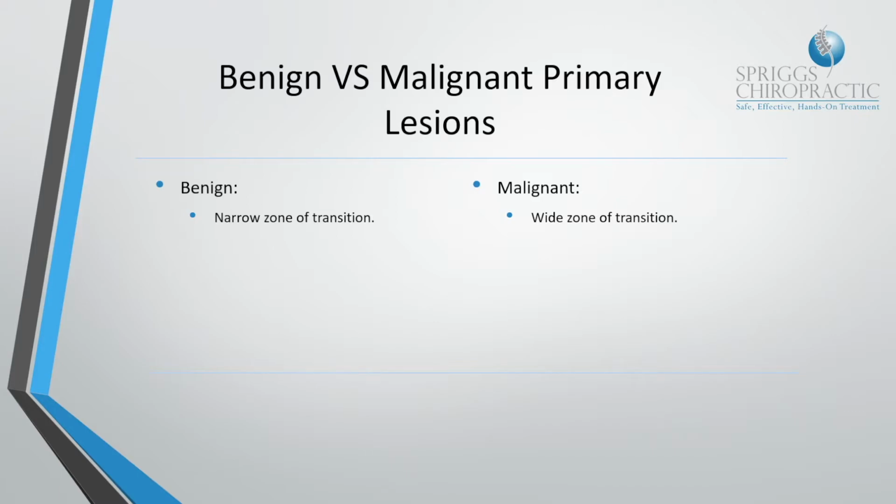Both of these can be solitary or multiple lesions. The reason I've put this up is that when we're talking about solitary or multiple bone lesions, malignant processes will spread to adjacent areas, and that's one way of seeing multiplication of the same tumour process elsewhere in the same bone. Or, if we've got multiple benign tumour processes, such as a patient with Ollier's syndrome with multiple enchondromas, they all look very similar to one another. The process itself is similar amongst all the different bones, or the different areas of the bones, that you can see.